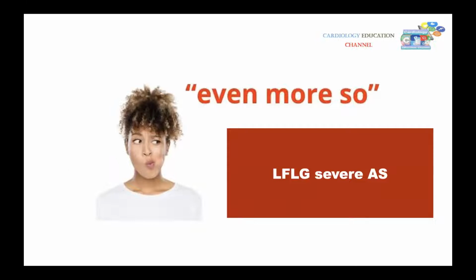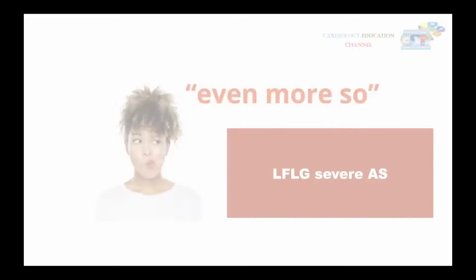This patient has an impaired systolic function, and you may need to know if you're going to tackle this aortic valve or not. So this is a very advantageous added value of dobutamine stress echocardiography, but this is beyond the scope of this lecture. But you should be aware that if you have a patient, you need to assess it. So your choice is going more to dobutamine stress echocardiography.